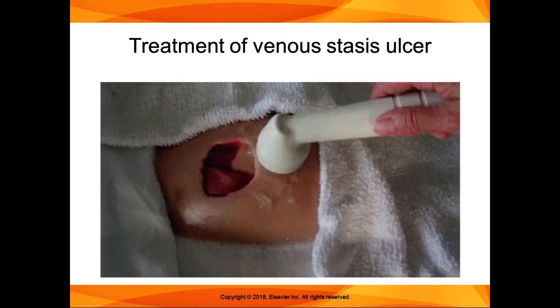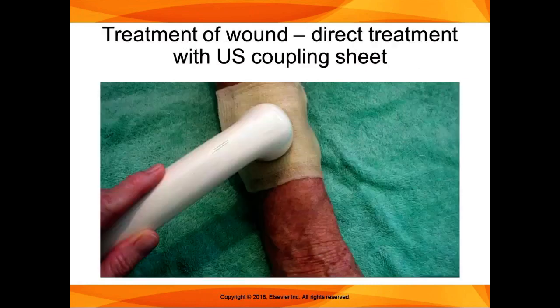So this is treatment of ultrasound for a venous stasis ulcer. This is using an ultrasound coupling sheet for direct treatment on a wound.